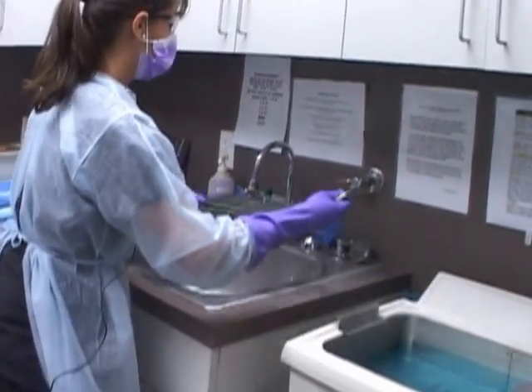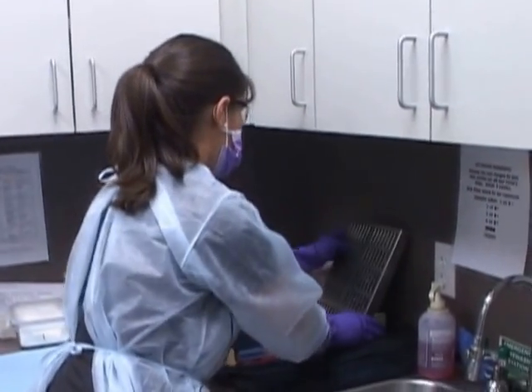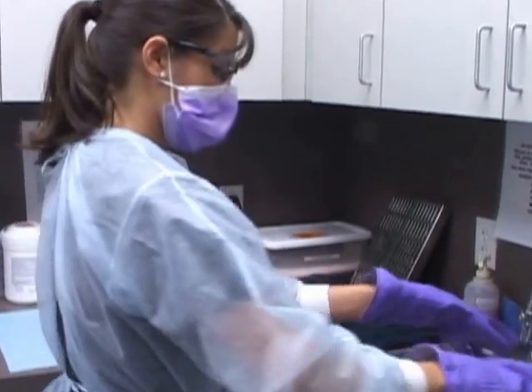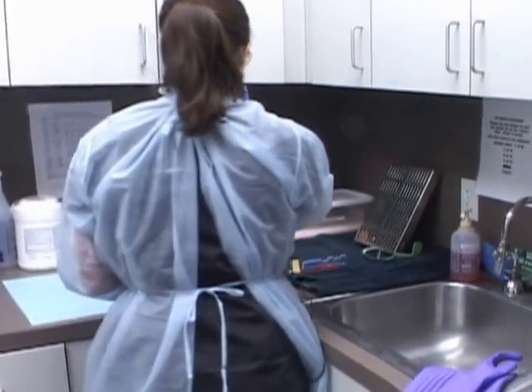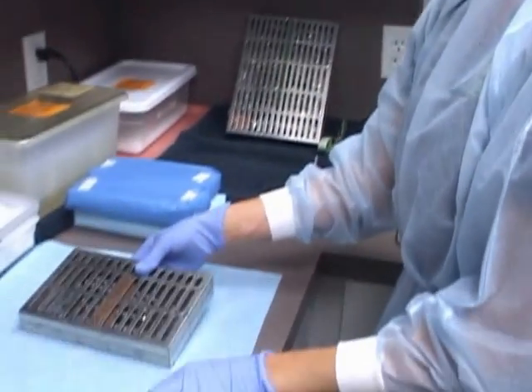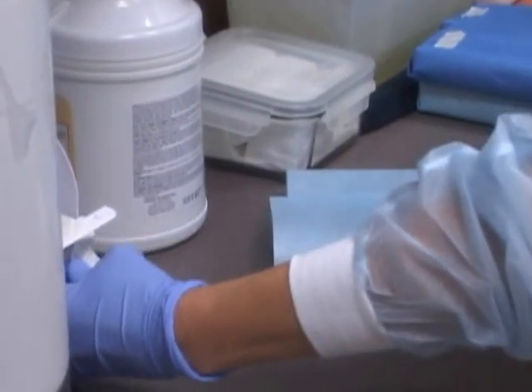After the ultrasonic has run, they are rinsed and dried. Wrap to ensure sterility. Indicator tape is placed on a wrapped cassette. This indicator tape changes color, letting us know that the sterilization process has occurred.